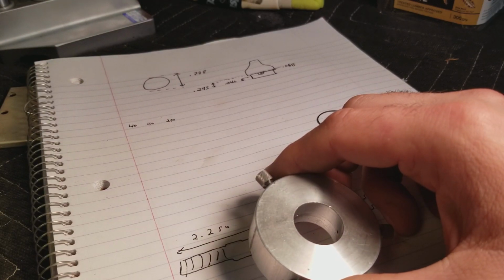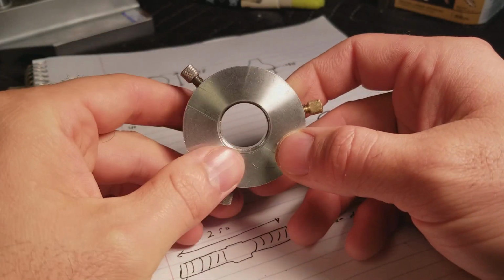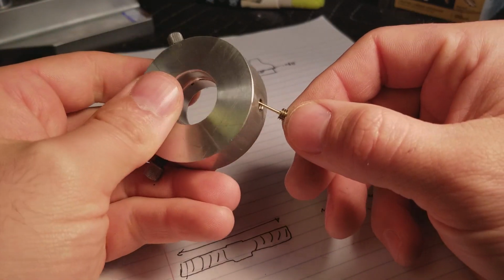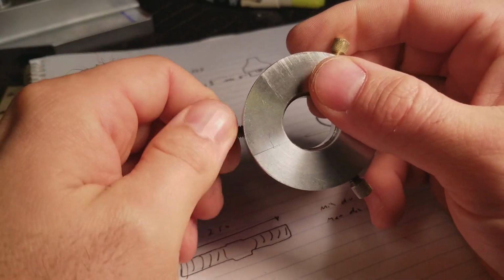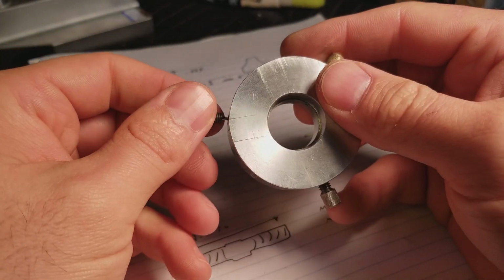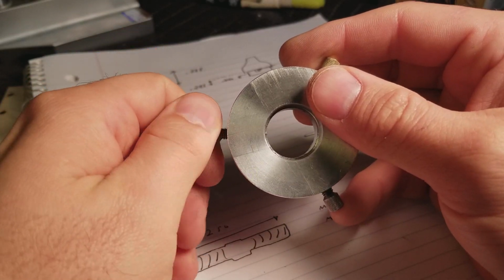All right, that's about all I got as far as this goes. Pretty simple tool. I started out with brass for these screws, but I found it'll be a little bit too soft, and so this piece here would bend a little bit under the heavy load of the nut that was a little bit more stuck. So I made a couple out of some 12L14, just mild steel, which have held up a little bit better, but you can see this one's actually bent a little bit as well. So I guess you could do tool steel. A little worried about getting too hard though. I didn't want to mar the pieces inside, but this worked out pretty good.